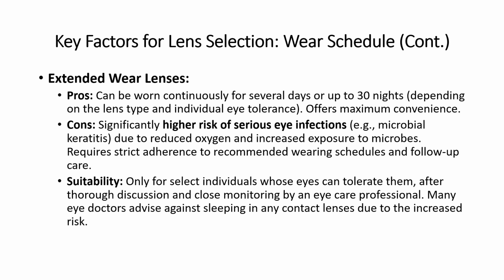Continuing with wear schedules, extended wear lenses are designed to be worn continuously for several days or up to 30 nights, depending on the lens type and individual eye tolerance, offering maximum convenience. However, they come with a significantly higher risk of serious eye infections, such as microbial keratitis, due to reduced oxygen to the eye and increased exposure to microbes over prolonged periods.